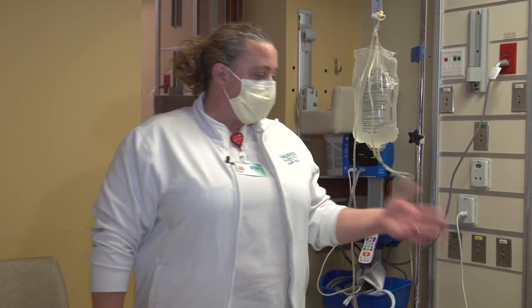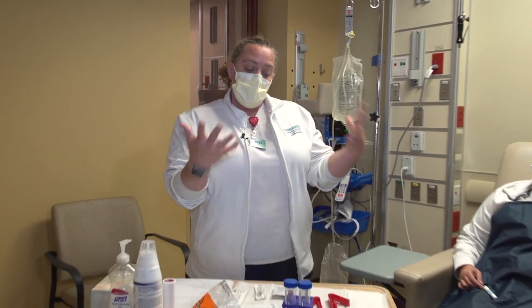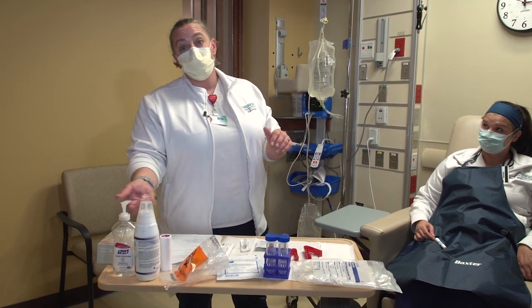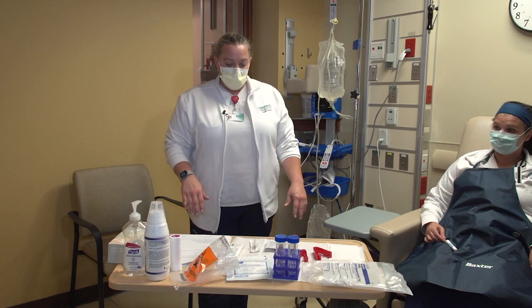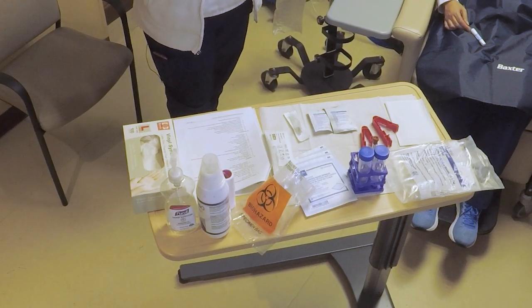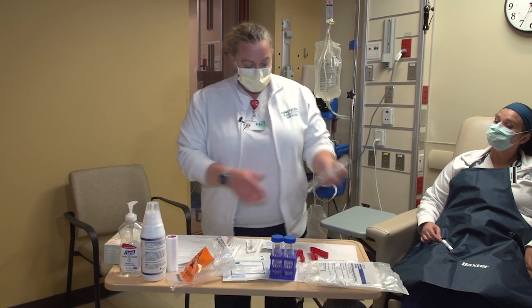The process for filling and draining, I'm going to go through a demonstration. The first thing that you're going to do, as we do for all peritoneal patients, is wash our hands for 2 minutes. I have washed my hands for 2 minutes already today, so I'm going to just continue using the hand sanitizer. Okay. I have all my supplies laid out, and the supplies are listed on the SOP. And make sure everybody in the room, including the patient, is masked.